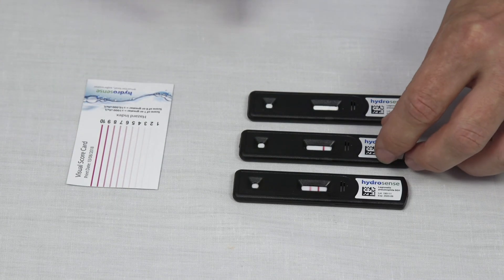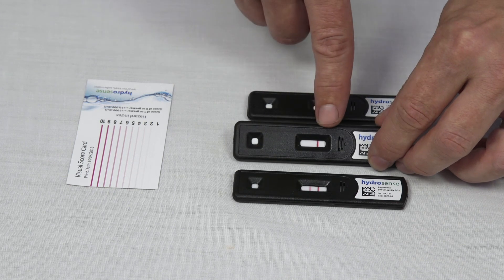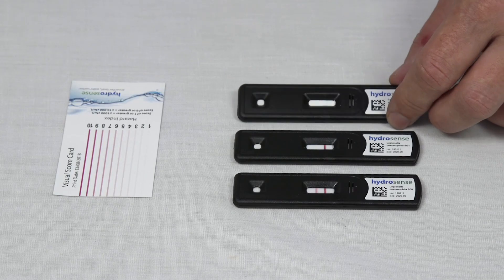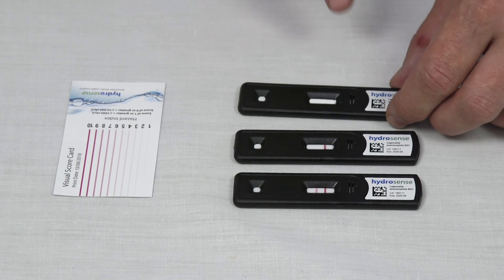If the test shows one line in the control line position, then the test is negative and Legionella pneumophila serogroup 1 has not been detected. If no control line is present, then the test is invalid and should be repeated.